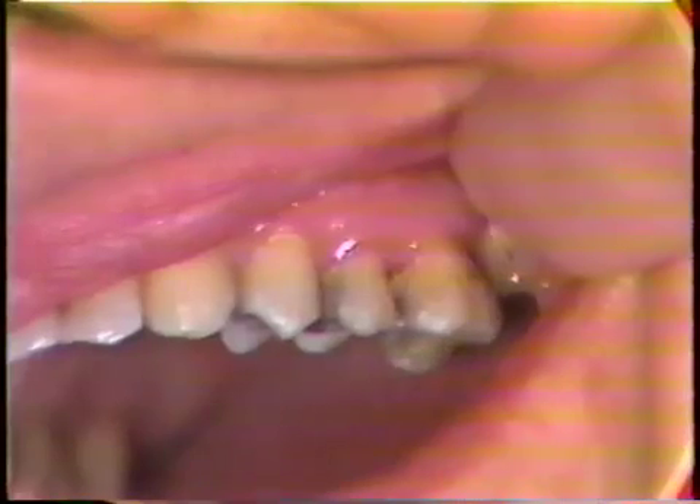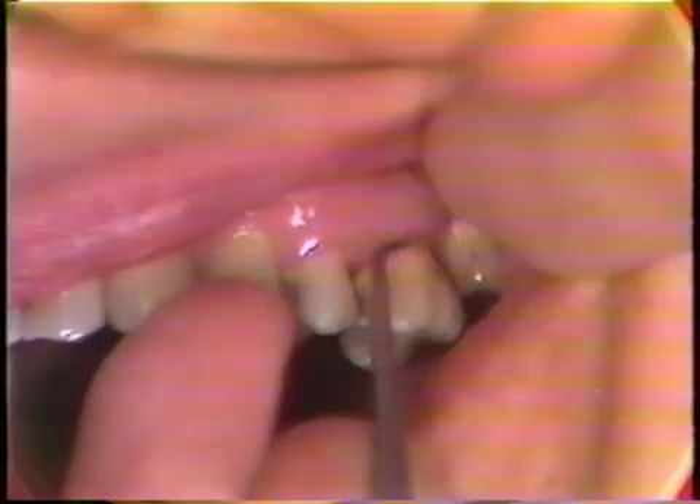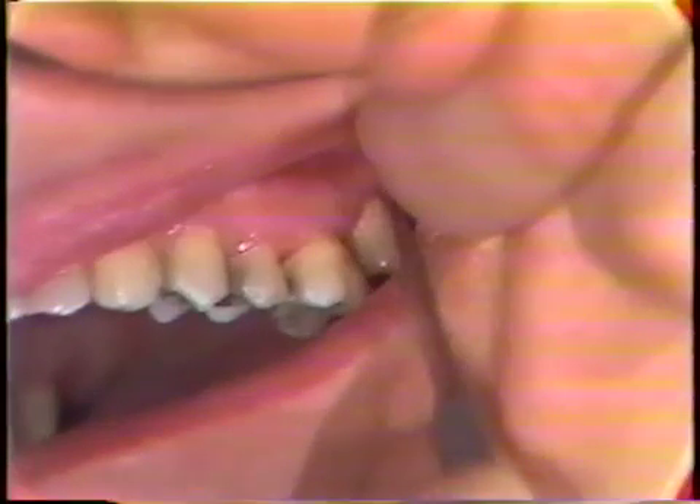The next step is to use the scaler again to remove any bits of dressing material that have adhered to the coronal portions of the teeth. This is very similar to removing stain on the crowns of teeth. On this molar there is some dressing material still there that I'll remove now, in a scaling manner, moving the instrument coronally — actually scaling over the crowns of the teeth to remove any excess dressing material. I'll go right around all these teeth to remove any excess material. On the lingual, it's the same procedure as was just carried out on the buccal surface.